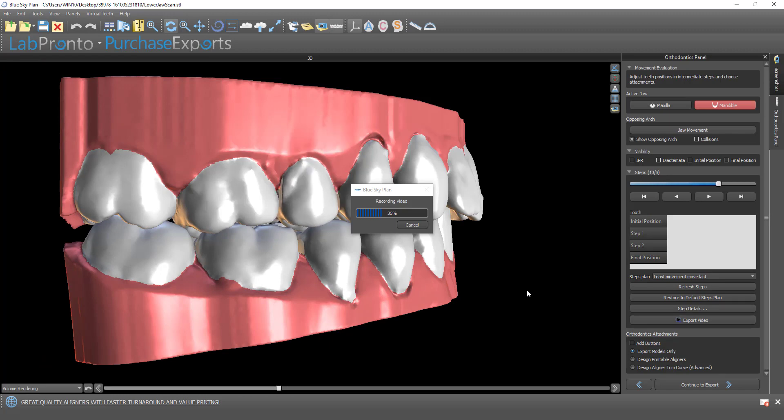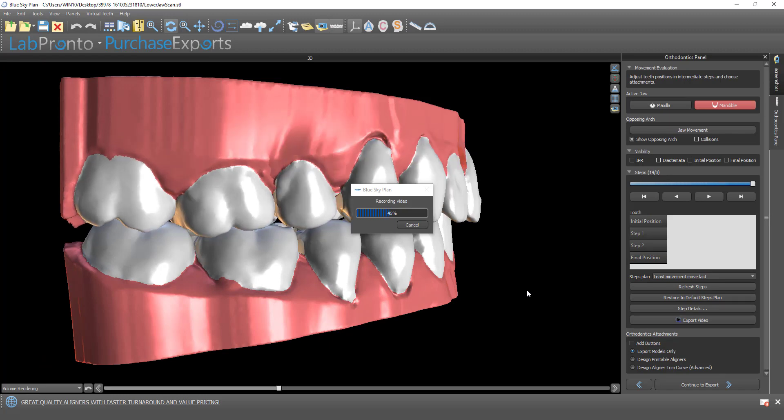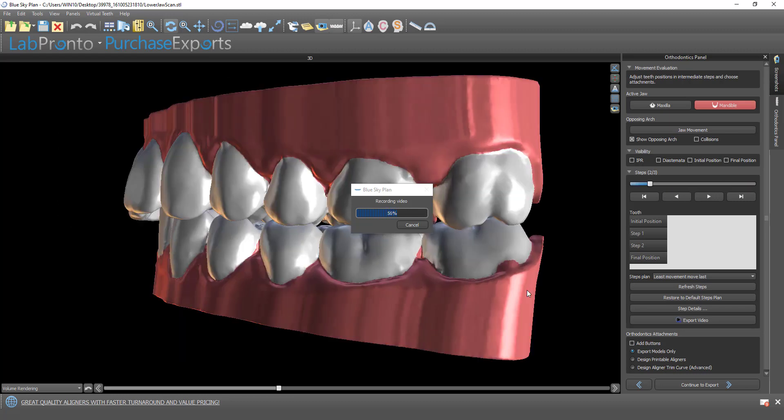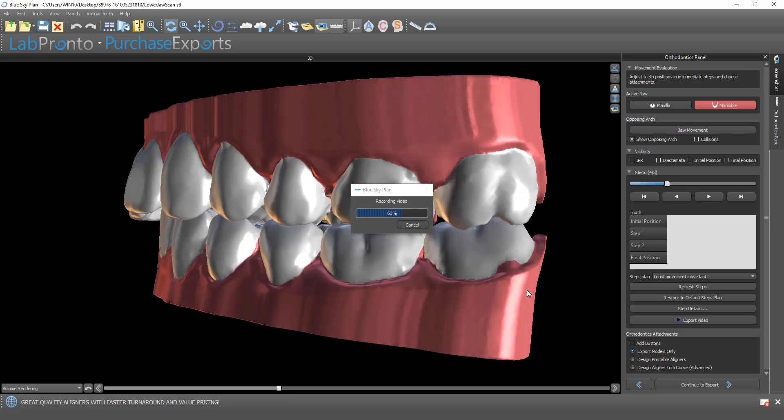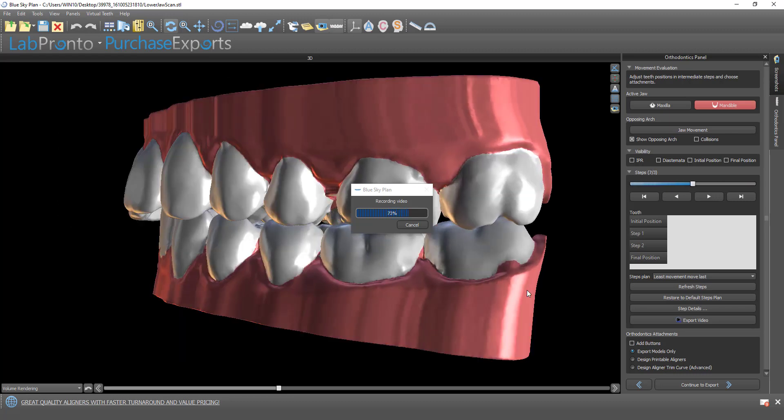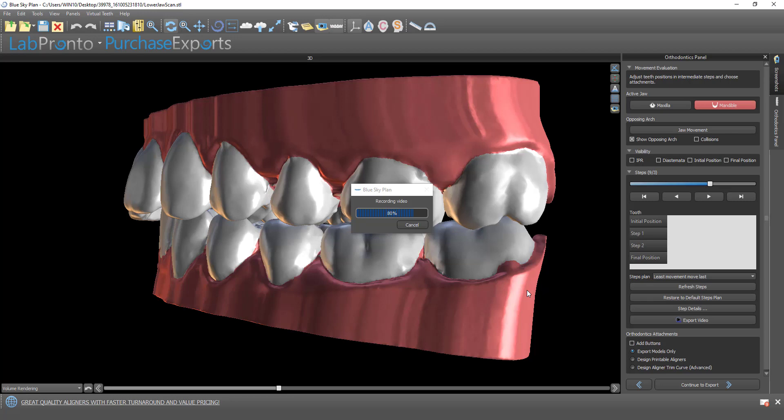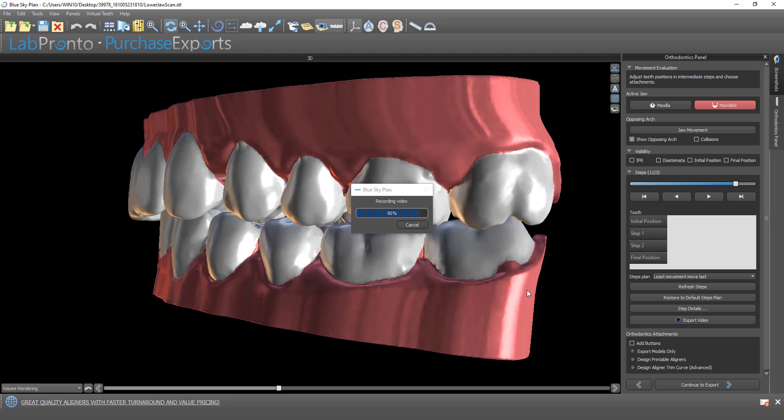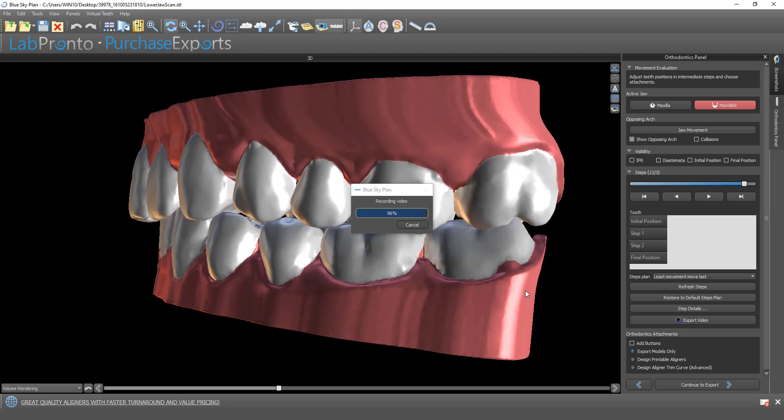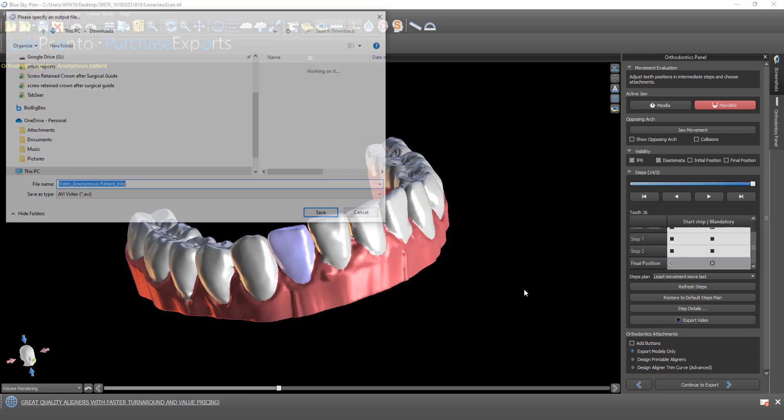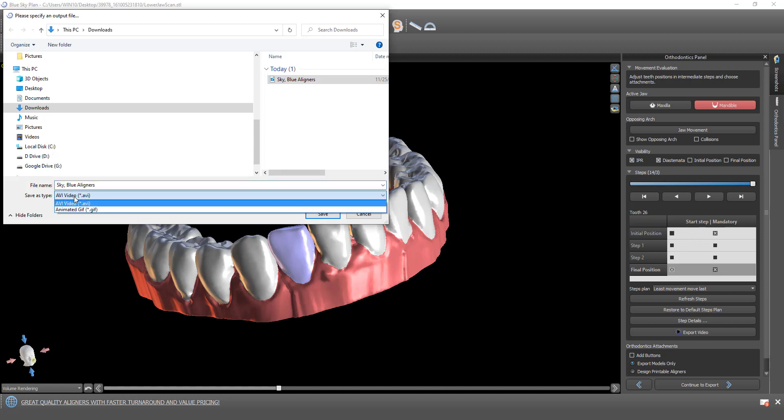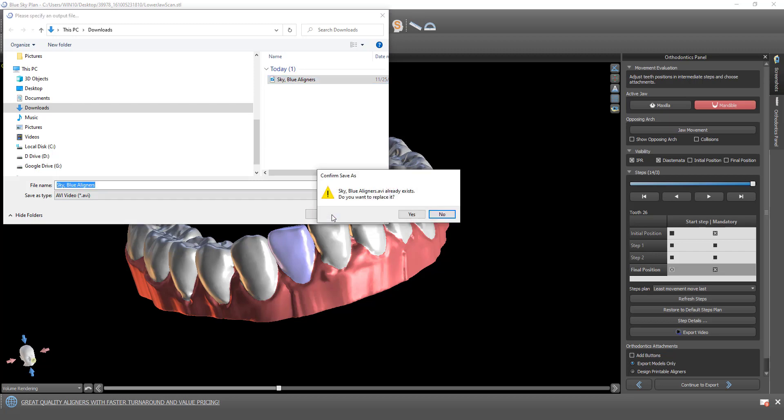Now the software is generating the video for us. And when it's done, we're going to have a save option dialog box that comes up on the screen that allows us to save the video as a video file or as a moving GIF, and to give it a name and choose location. I'm going to use the name Sky Blue Aligners. Here we have an option for video or an animated GIF.